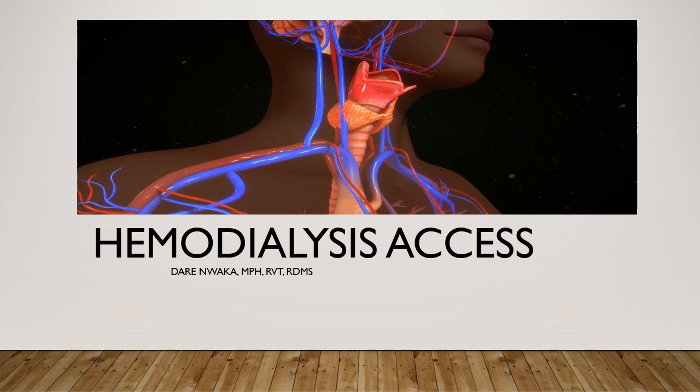Today we'll be discussing hemodialysis access and also complications associated with hemodialysis access.